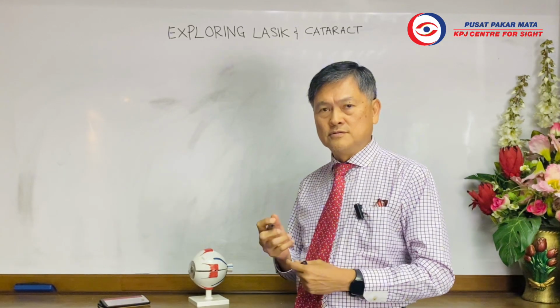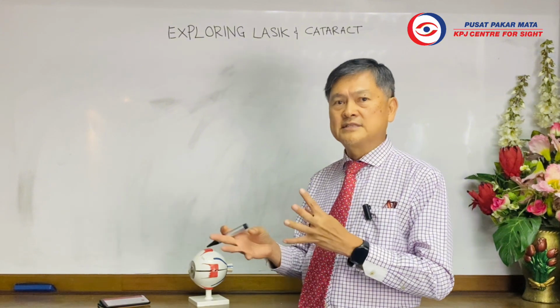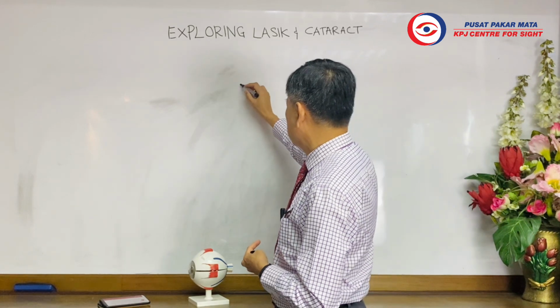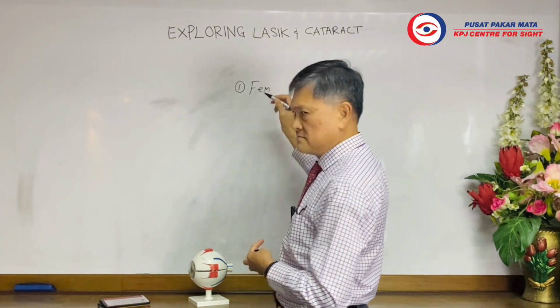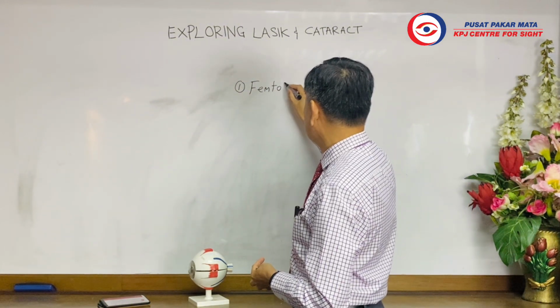When it comes to laser vision correction, there are a number of different approaches. What you have now in the market, number one, which you can find in most laser centers, is called femto LASIK.